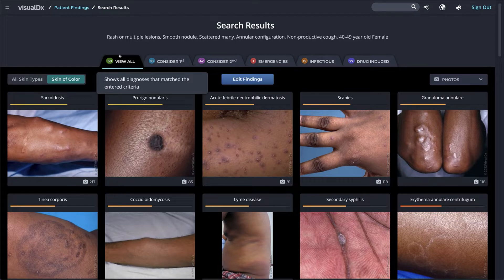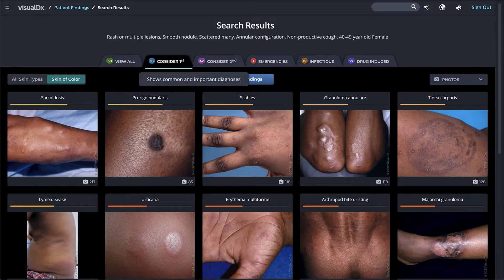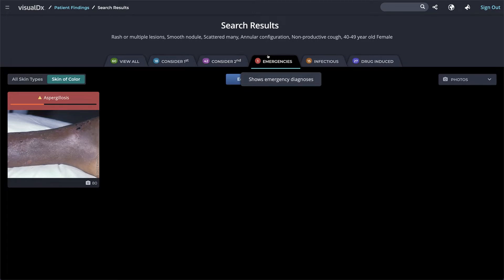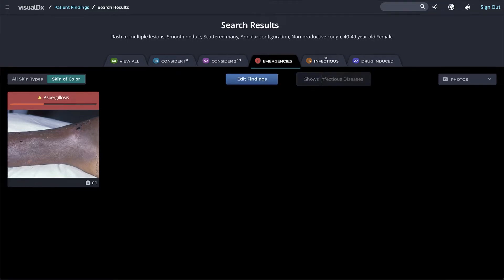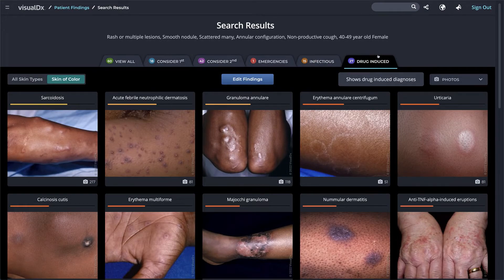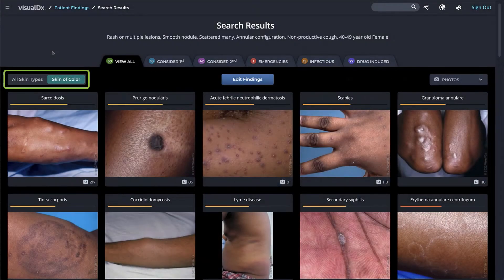Consider First shows the most common and important diagnoses. Consider Second shows uncommon and rare diagnoses. Emergencies groups all diagnoses classified as emergencies, whether they are life-threatening or require immediate attention. Infectious shows infectious diseases. If you enter a travel finding such as Puerto Rico or Florida at any point in your workup, the Infectious tab will default to the front in your differential results. Drug Induced shows any drug-related diagnoses; if you enter a medication as a chief complaint, the Drug Induced tab will appear first.